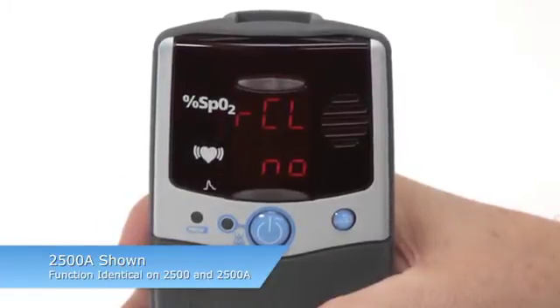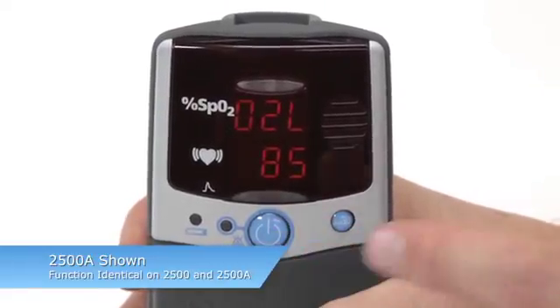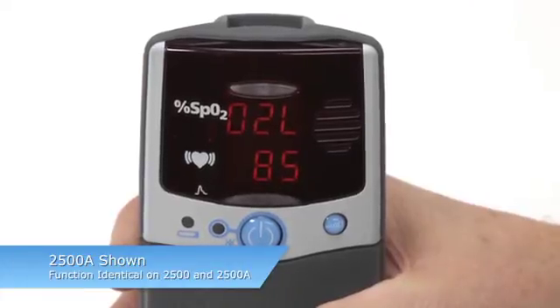Re-enter Setup Mode and select CLEAR NO to proceed to the rest of the setup options. If you do not clear memory, you will automatically continue to the rest of the setup options.